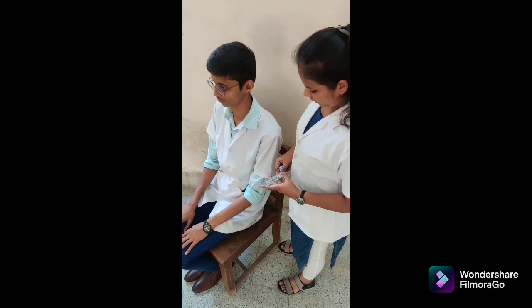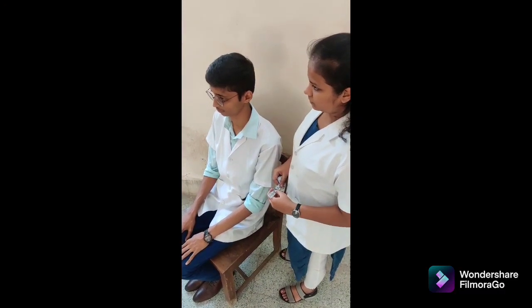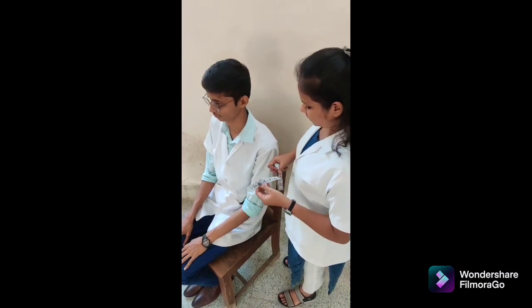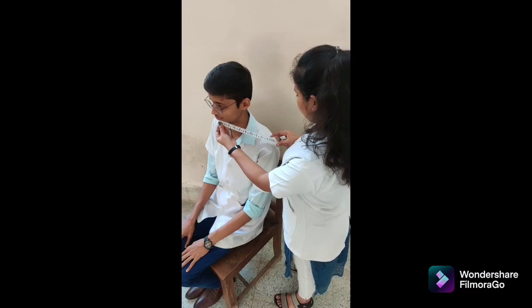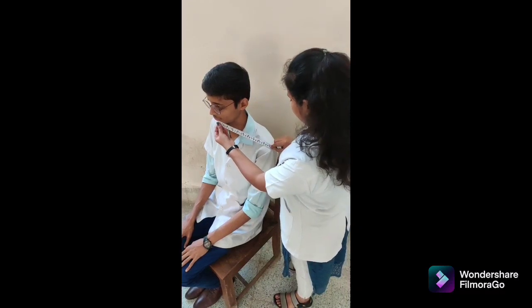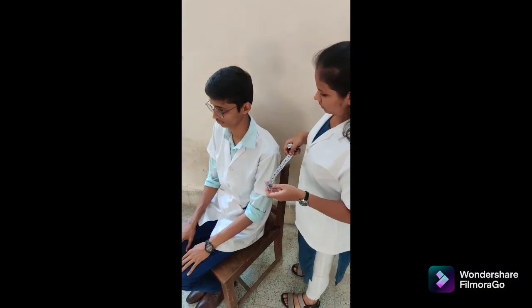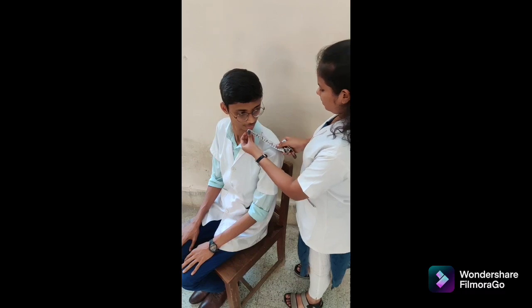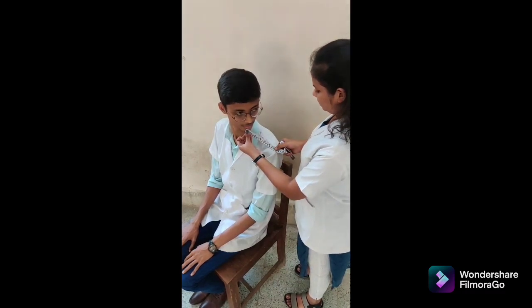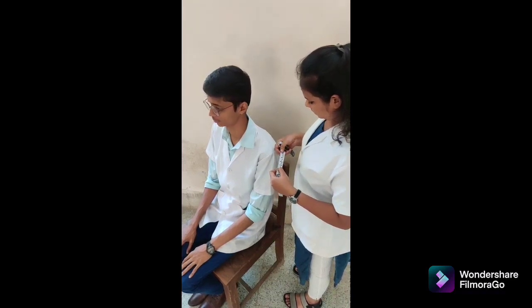We are going to perform cervical rotation with tape. Patient position: high seating with thoracic and lumbar spine supported by back of chair. Tape alignment: place a mark on the tip of the chin and the acromial process, and measure the distance. Instruction: roll the head into rotation. Measure the distance between the two marks at the end of the motion.